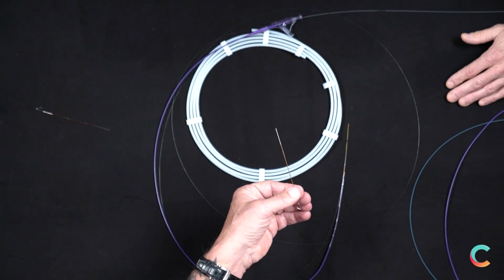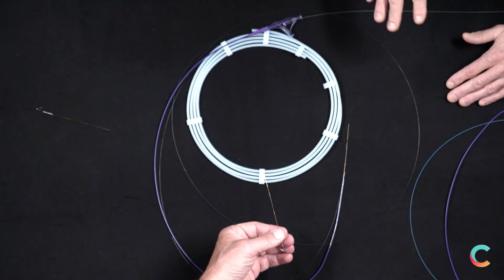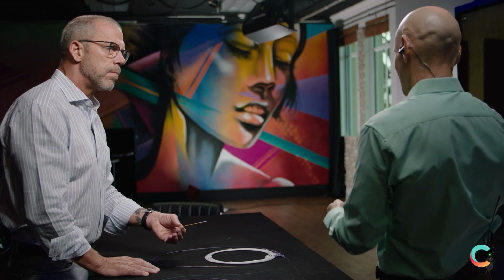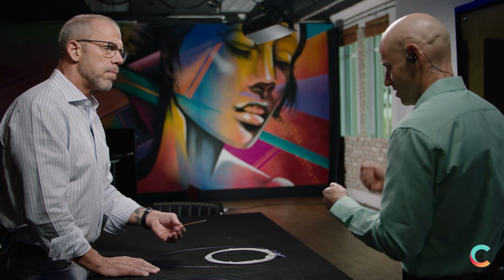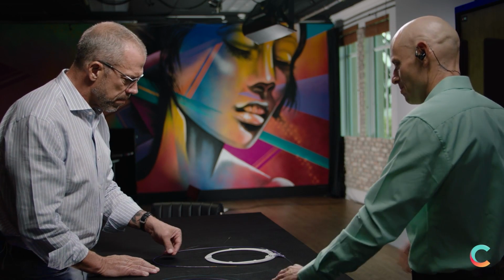That's right, yeah. And then you can use the same backbone, the same base module for all of those adapters, for anything, right? So now you're adapting it. It's kind of to Gary's point. You're basically adapting your equipment for what's happening during the procedure. So instead of exchanging a guide wire, I'm just going to downsize my catheter, so I'm using a smaller guide wire. Those are the types of embodiments we're thinking of.